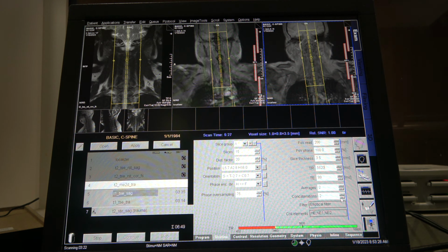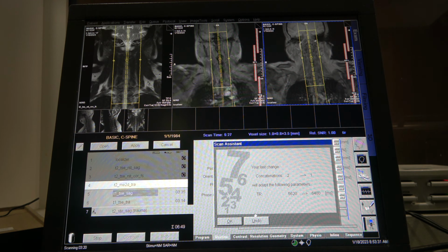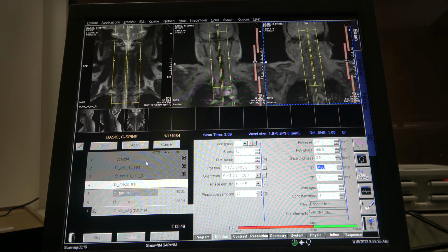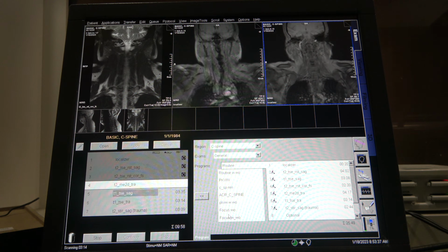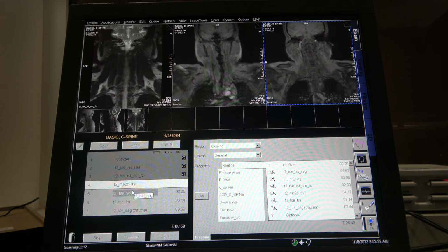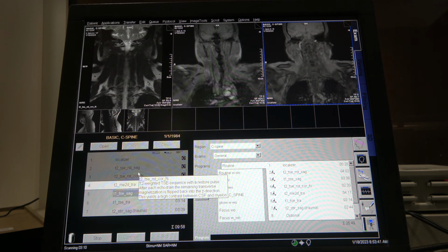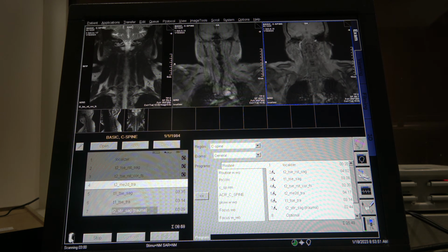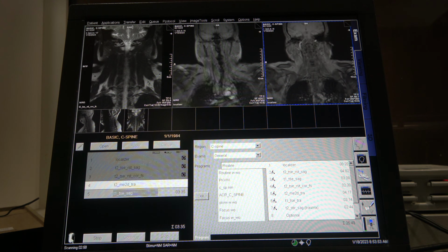What do we got here? So we'll take one out. It's not bad. Just like that. Hit OK, and that's it. You're done. You set it up. Hopefully the patient's nice and comfortable, and they're able to do what, 10 plus 13 more minutes, and they'll be done. But we're not going to do that for our volunteer. We're just going to do 3.